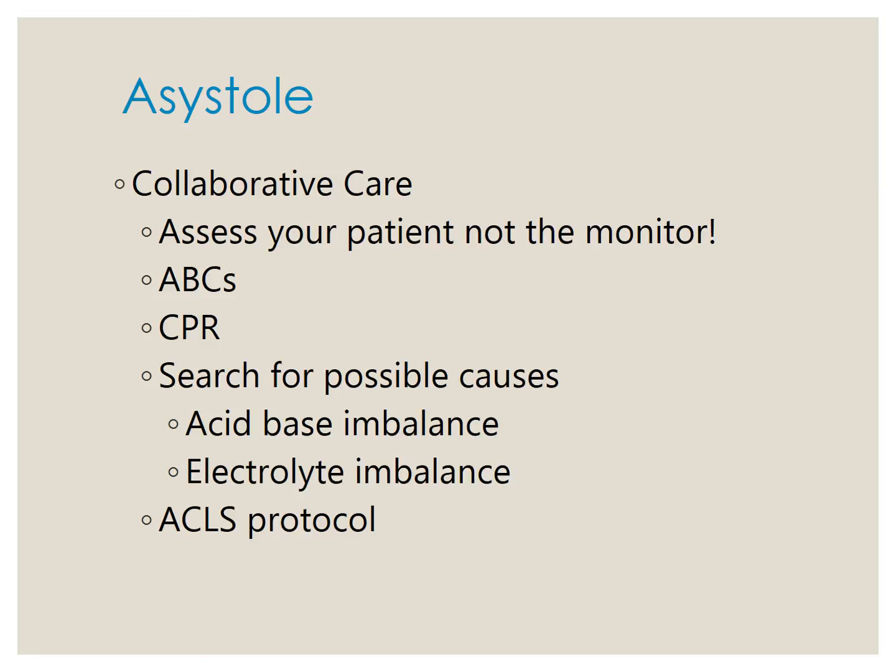They cannot be in asystole if they have a pulse. Okay, so you may switch to another lead and check the electrodes to make sure it is true asystole. If they are unconscious and you don't feel a pulse, you check your ABCs, you initiate CPR. Again, jump on that chest. When I say jump, I mean just start compressions. You're not physically jumping because I can see you guys trying to imagine what I'm saying here. When we jump on the chest, we just start compressions right away. You don't even think about it. Someone just start those compressions. That's what we need. And call for help, okay, because we do need more help.